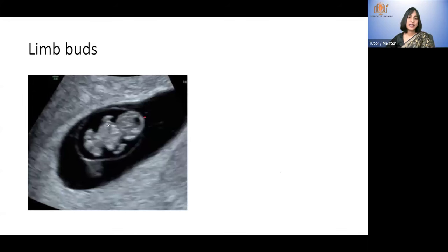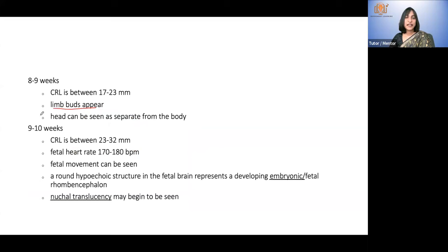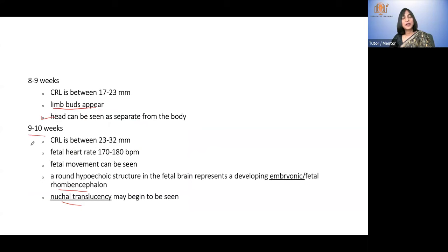You can see nicely the cephalic and caudal poles; the resolution is good enough to see the amniotic sac all around and the yolk sac is no longer visible. These are the upper limb buds and these are the lower limb buds. In the head there is a hypoechoic area called the rhombencephalon — the early developing brain. Limb buds have appeared and the head can be seen separate from the body. Nuchal translucency starts to be visible from 10 weeks but can only be measured and used for aneuploidy risk from 11 weeks.